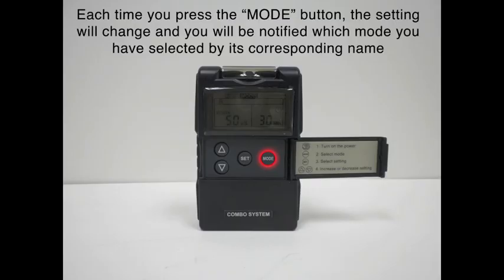Hit it one more time and we have modulation mode, then SD1 mode, SD2 mode. Press it one more time and we're in the EMS mode for synchronous, and then alternating.